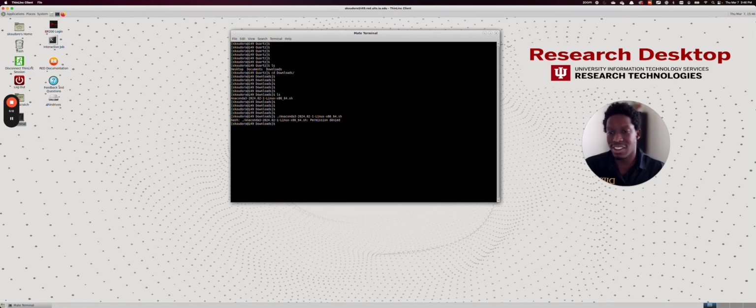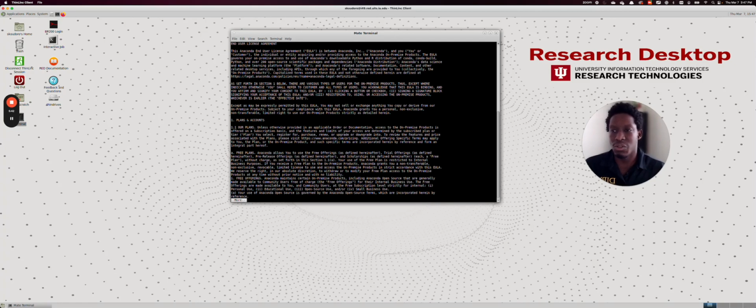So as you can see that here I have this surprise of permission denied to run this script. So I will try to call it via a bash script. So I can call, there is many ways to do that. I can call directly sh, the Anaconda, okay? Or I could do bash. So now that I call sh, you can see that he asked me about the license agreement, and here we press enter to say that we agree with the agreement.